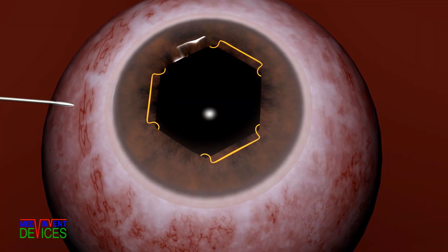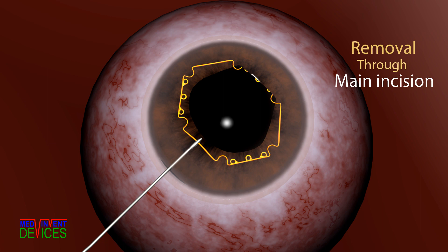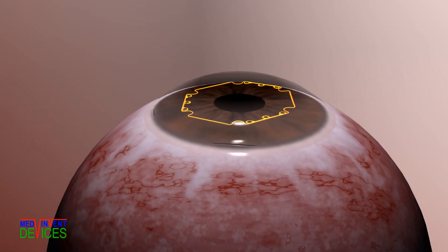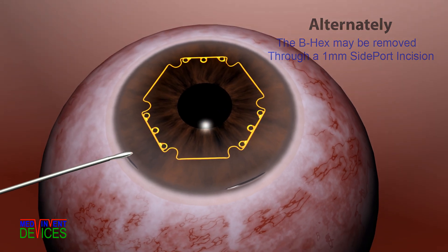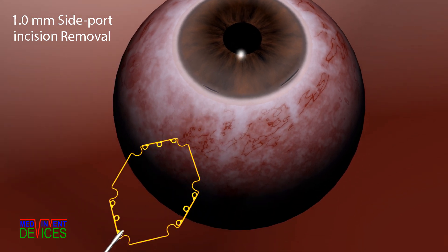For removal, a flange is held and moved centrally, disengaging the two notches on either side. As the B-Hex is drawn out of the main incision, the trailing notches disengage spontaneously. In fact, removal is so much easier than other devices that the B-Hex can exit even through a 1 mm side port incision.